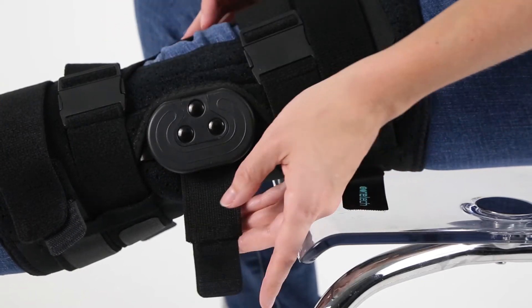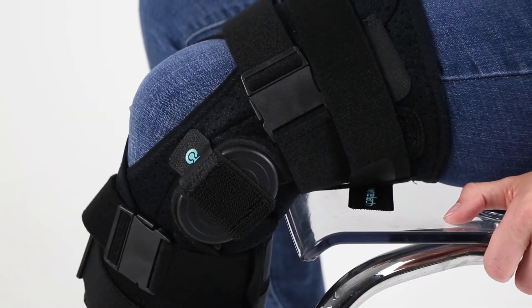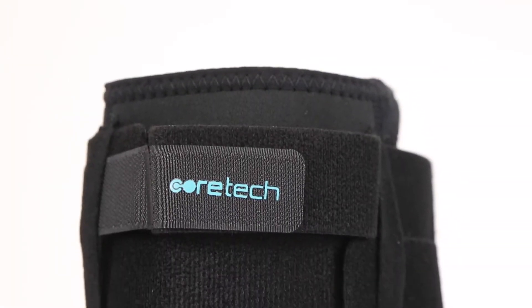This knee brace is the ultimate injury recovery brace, providing medial as well as lateral support, a hinge angle immobilization selector, above and below knee support straps, and mid compression.